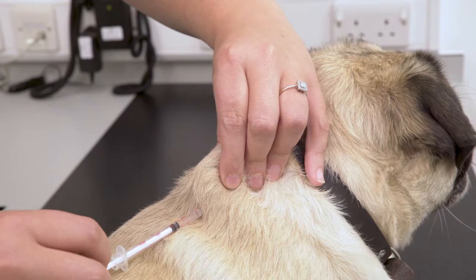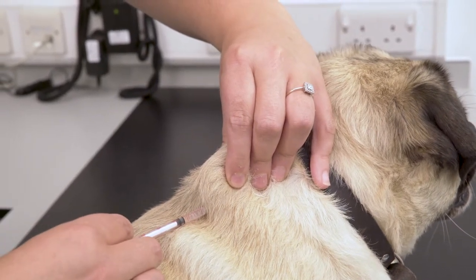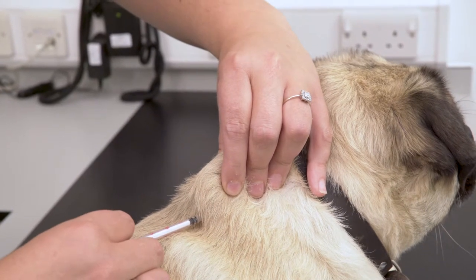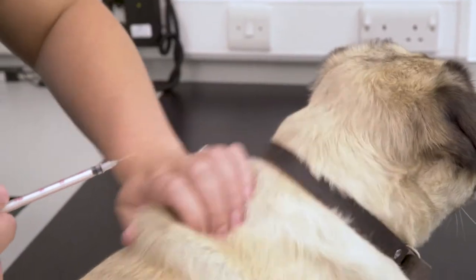Relax the hands slightly before drawing back to check no blood is present, before pushing the plunger to perform the injection. Pull the needle out and give it a rub.